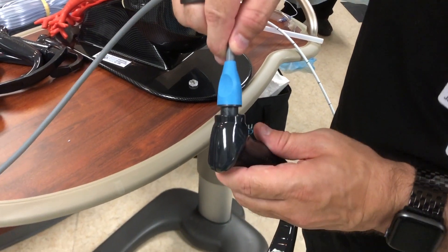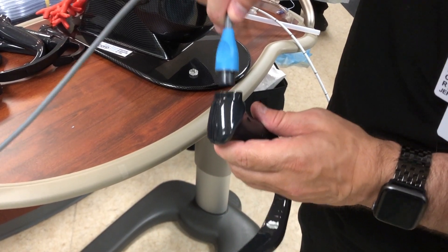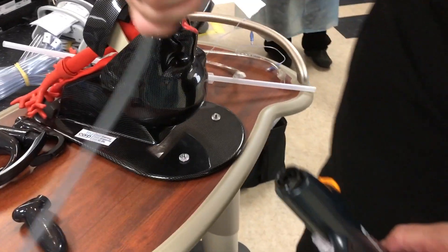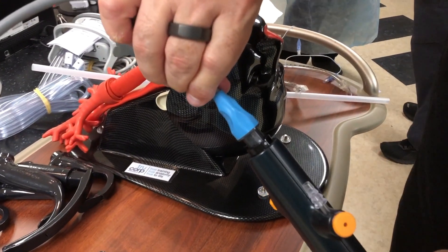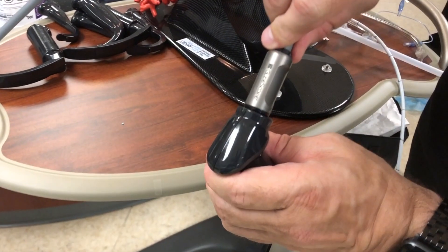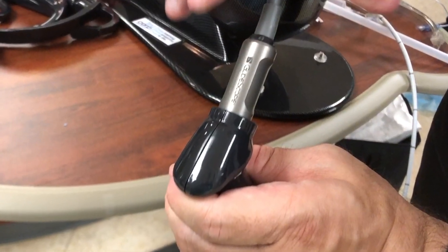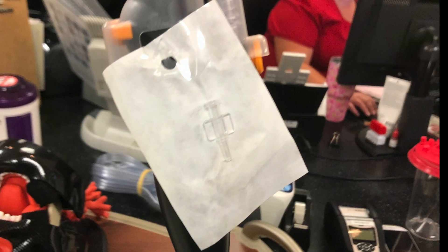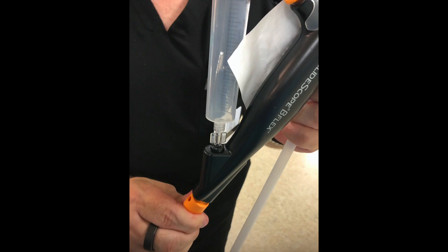Don't be this guy — the round plug is for the fiber optic, not for the GlideScope blade. Line up the word 'GlideScope' with the blade so you know you're plugging it in the right direction. If you want to infuse drugs or irrigate through the fiber scope, use this little adapter: plug it into the side port and infuse to your heart's delight.